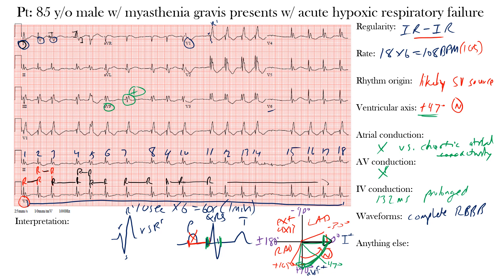You may have also noticed discordance between QRS complexes and T waves, along with ST-T wave abnormalities, which are likely secondary to the right bundle branch block. In lead V1, the QRS is mostly positive and the T wave goes in the opposite direction. The same in V2 — upright QRS with ST depression and inverted T waves. This is called discordance. Normally the QRS complex and T wave should go in the same direction, and here the abnormalities are secondary to the abnormal repolarization from the bundle branch block.